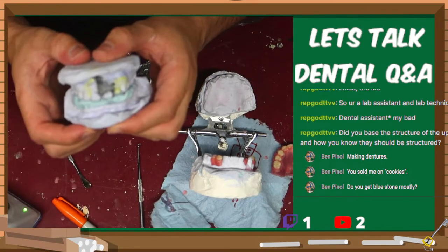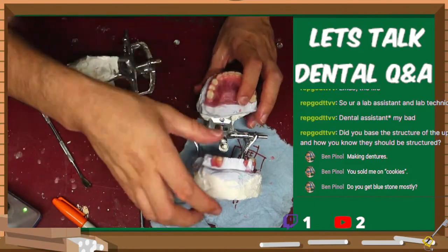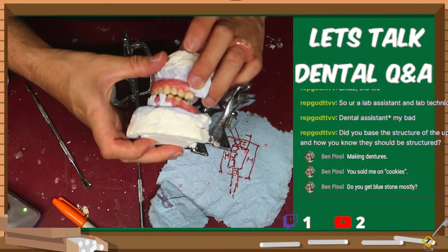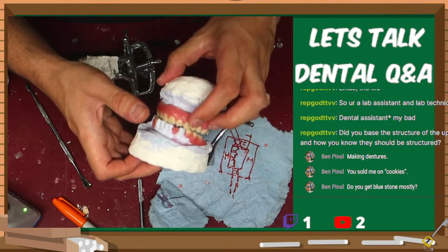And once I know that their bite is like this, just like I have right here, I can base it off of how I have them biting down or how the doctor wants them to bite down, what their orientation should be, how the teeth on the top should be occluding with the ones on the bottom.